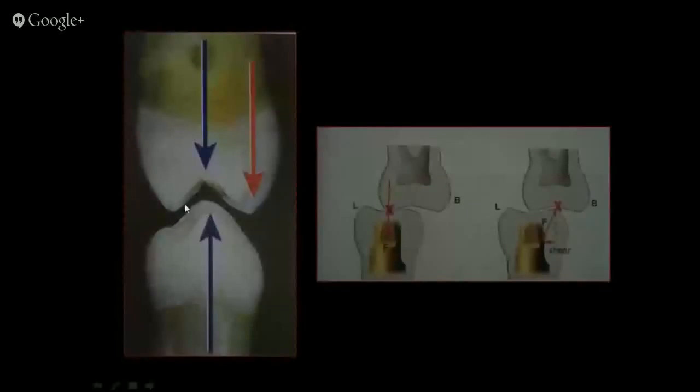That this part is my cuspal tip, and I do not want the cuspal tip to act as an interference, because if I want something to act axially, I want it over a flat surface, not a curved surface, not a raised surface.